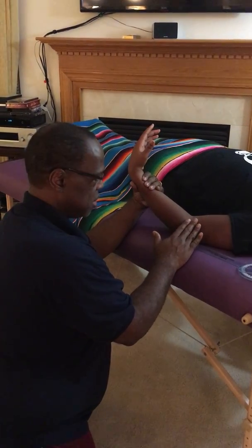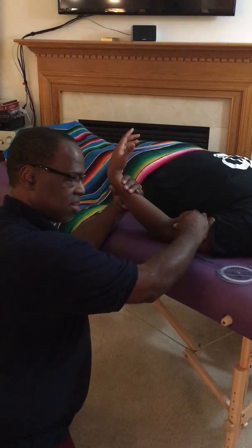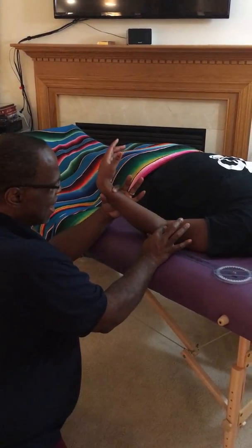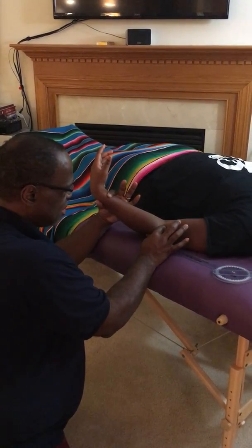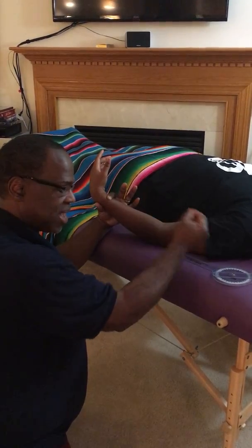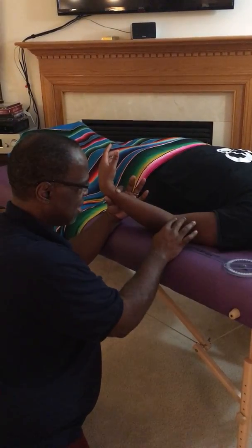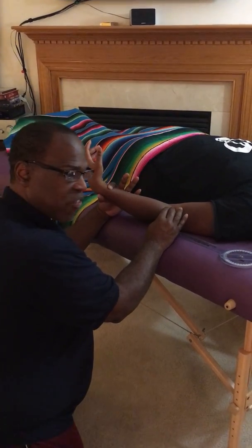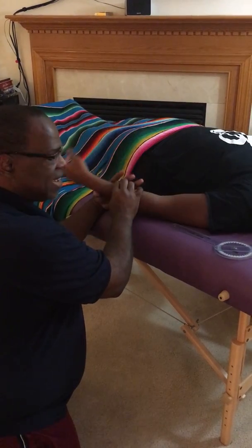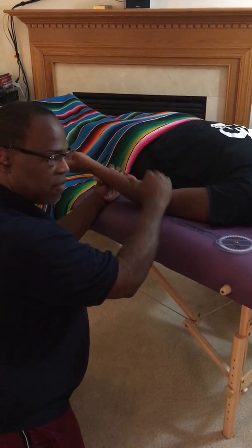An improvement would be if we put some heat, we do a massage, we do some stretching here at this bicep joint region, and an improvement would be if she went less into that extension, and let's say it's negative 35 or negative 30, that's an improvement. That means she got better. So we're looking for that number to become less, that negative number to become less. Negative 30, negative 25, until she gets to 0. All right, so she will always be considered a negative number for extension if she is sitting in flexion.